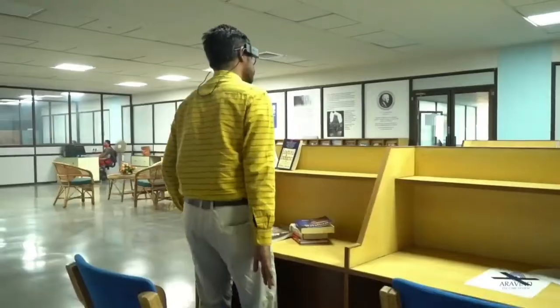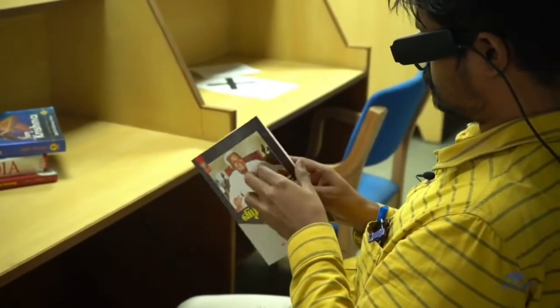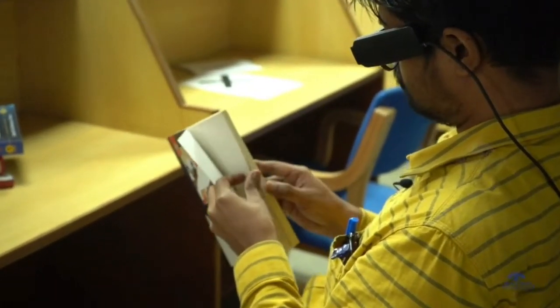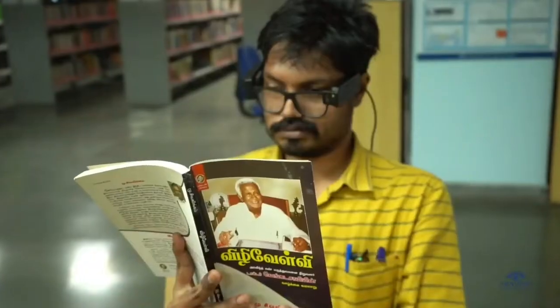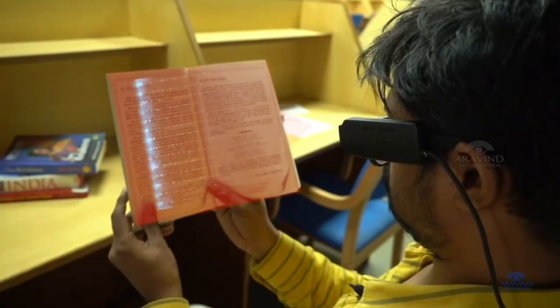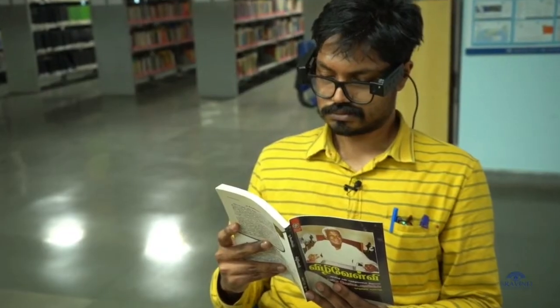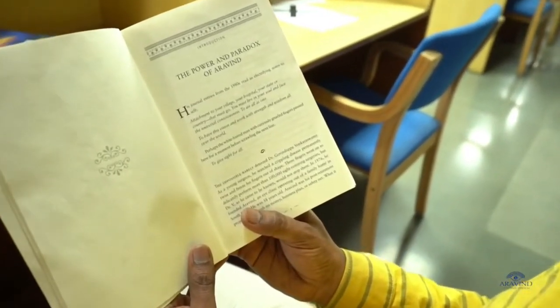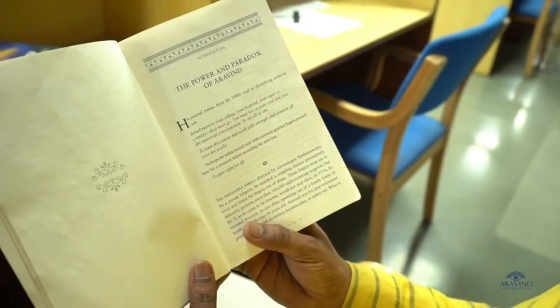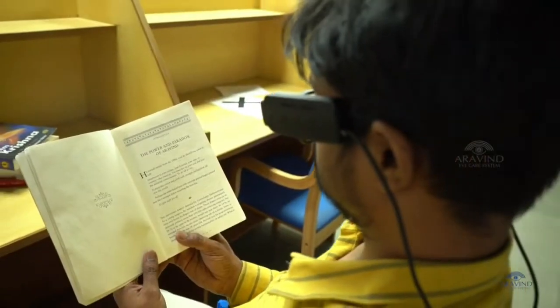By pressing the second button, letter R in Braille, the speaker will start interpreting the reading material kept in front of the camera. It has the capacity to interpret almost 73 Indian regional languages including English with Indian accent. It can read even handwritten materials.